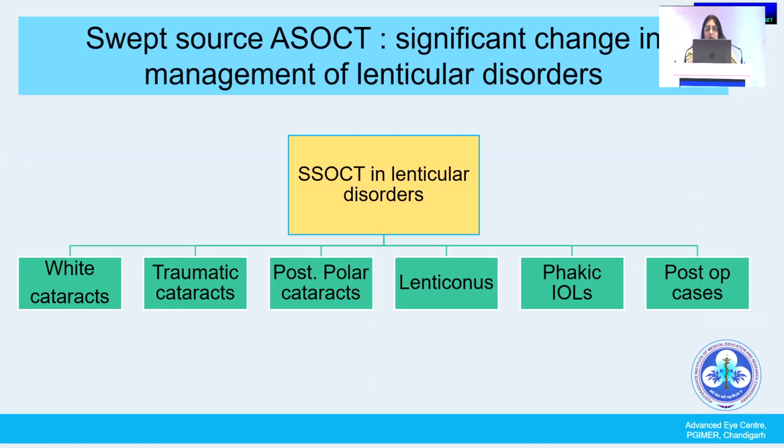Now, there are multiple purposes for which the swept source OCT can be used. And in fact, I would have to say that even in our department, beyond the cornea surgeons, the glaucoma surgeons as well as the strabismus surgeons are using the OCT as much as we are. But I limit myself to the corneal and lenticular applications. So the swept source OCT has brought about a significant change in the management of lenticular disorders because of our ability to see the lens.